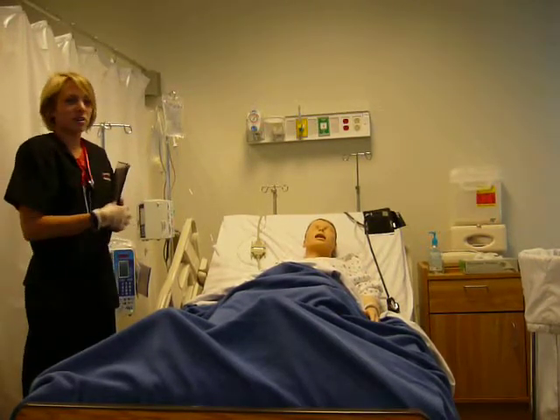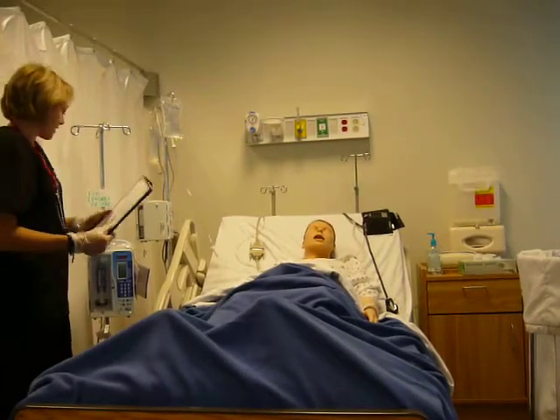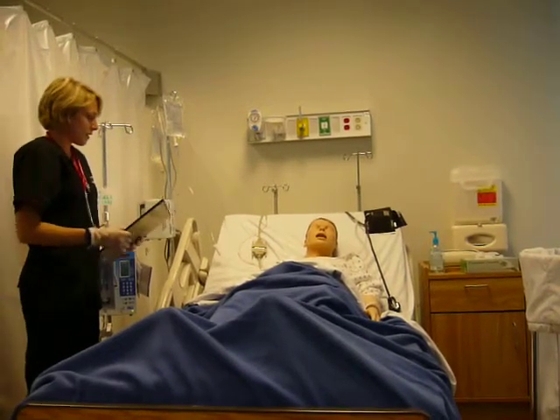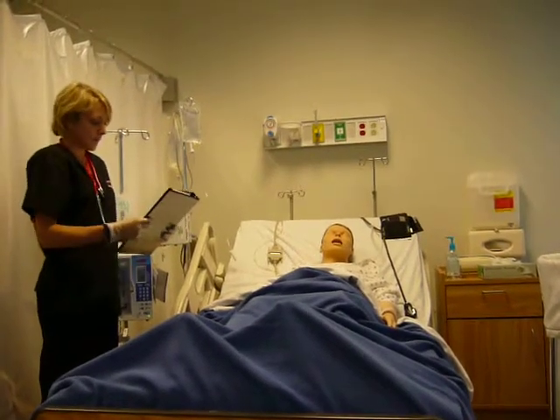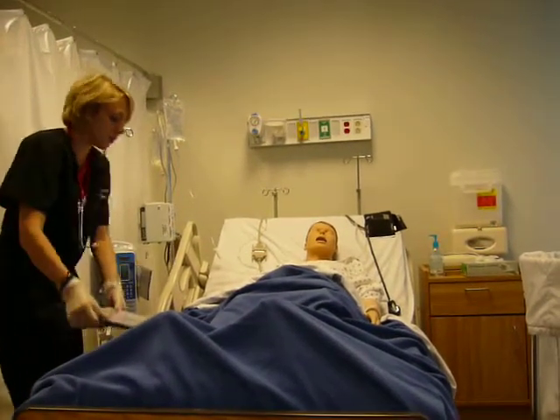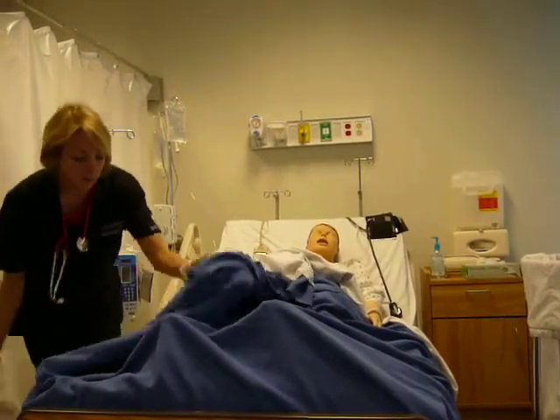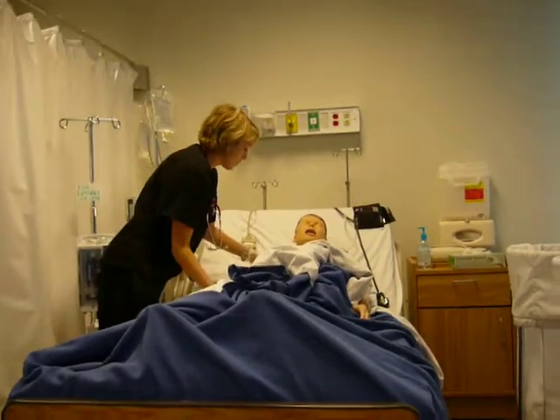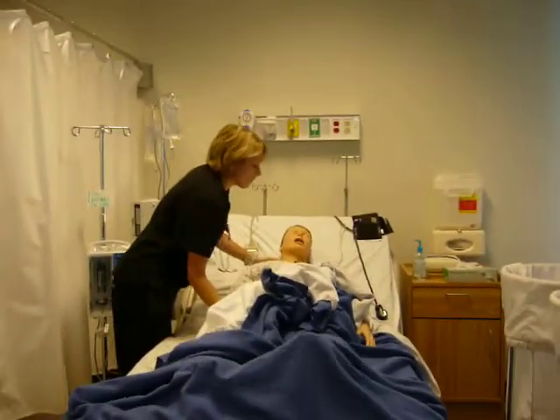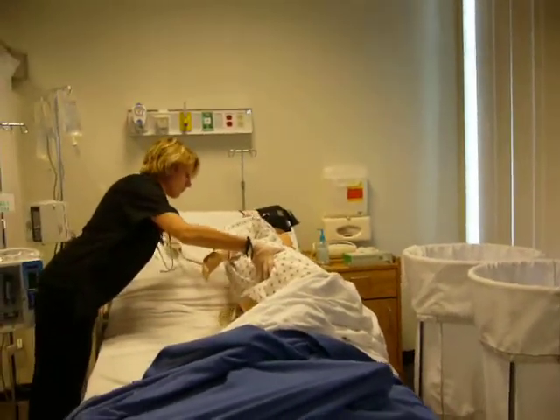Kelsey, can you confirm? I can confirm correct medication, correct patient, and correct rate. So then what you would want to do is make sure that all connection sites have been taped. On our patient, and on most patients, the connection sites are going to be on their lower back. If you turn the patient, you can see that all of the sites have been taped.